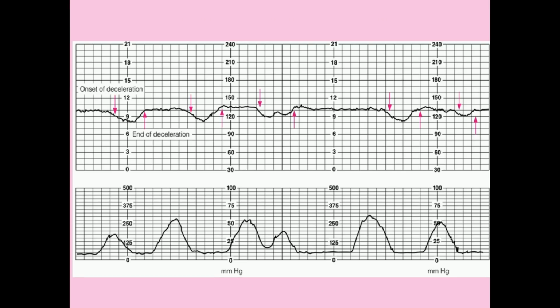Okay, what about this? What kind of decelerations are these? Your baseline here, about 130. I don't see any accelerations, but what do we see here? So where do these decelerations start? Well, the deceleration starts here, ends here. Starts here, ends here. Well, what about the contractions? Contraction starts here. Deceleration doesn't start till here, about 40-50 seconds later. This is late decelerations, non-reassuring.